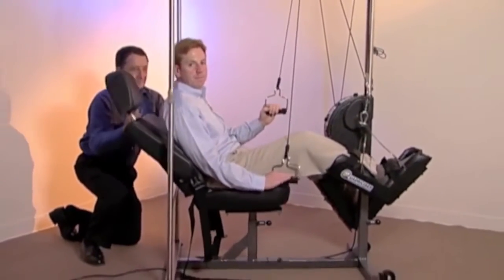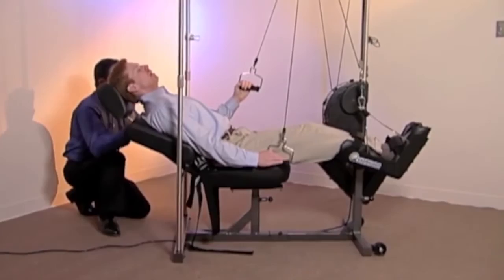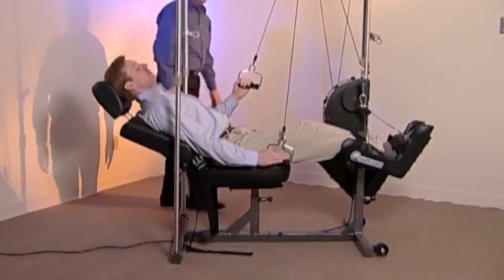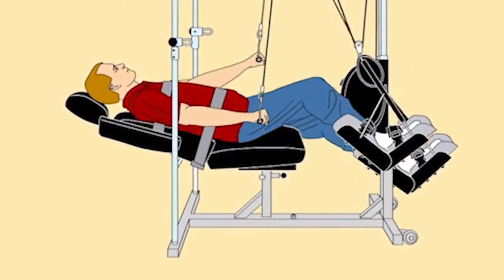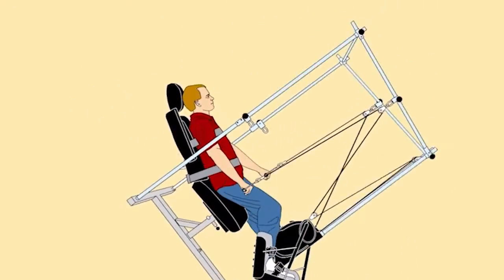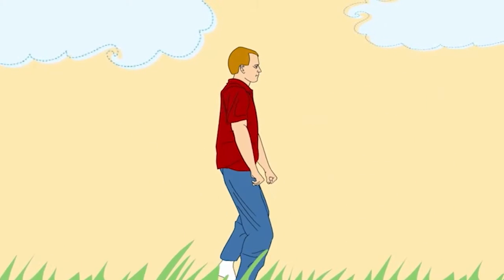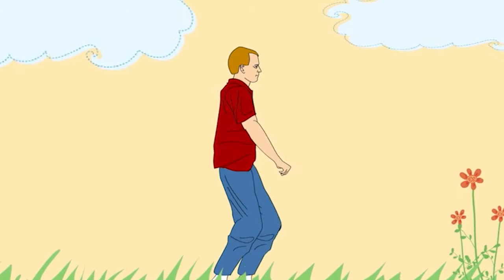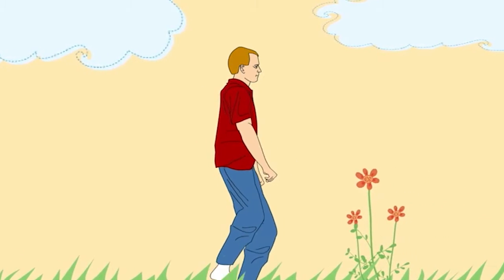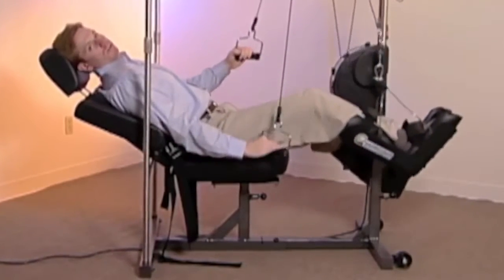By reclining the seat back and paying attention to your own body mechanics, the patient is positioned in an effort to mimic the normal gait pattern. The speed should result in a smooth and consistent range of motion in the upper and lower extremities, with the arms moving in opposition to one another from flexion to extension, as well as the lower extremities.